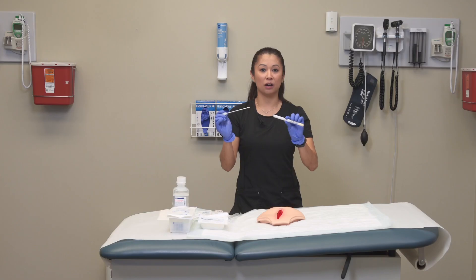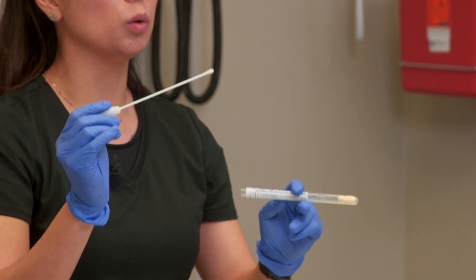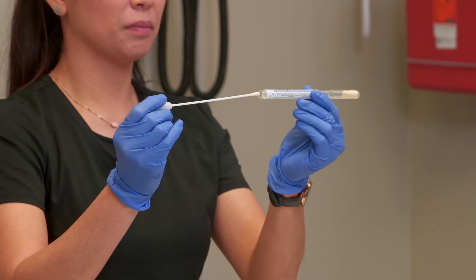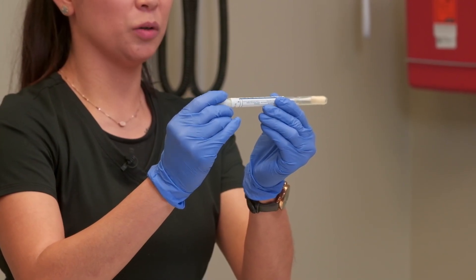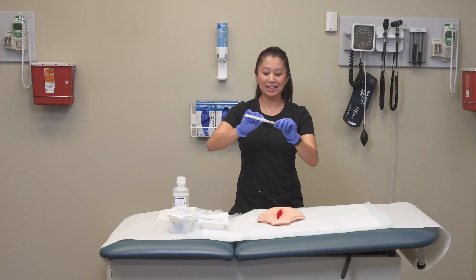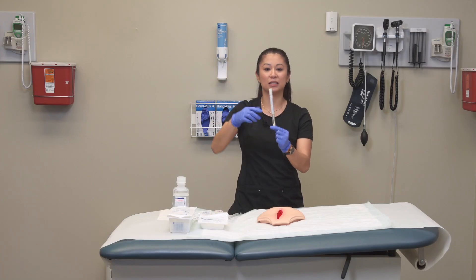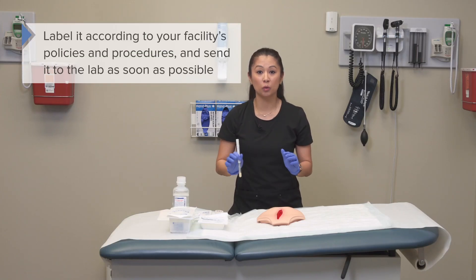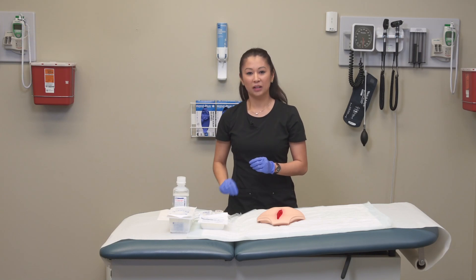Once you've swabbed, place the culture swab into the medium. Try to keep the swab from touching the sides of the tube so you don't lose the sample material — go straight in as much as possible. Label it according to your facility's policies and procedures, and send it to the lab as soon as possible.